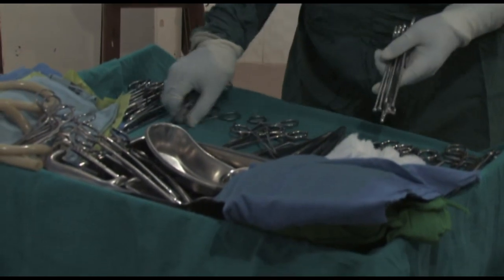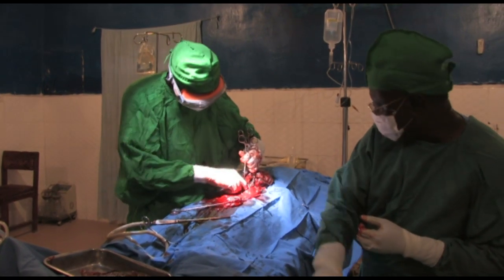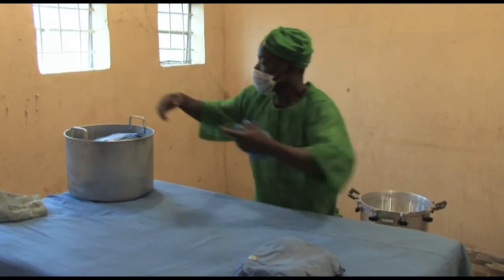The doctors and health professionals in the theatre and other departments may be the ones treating the patients, but the health of the patient is also your responsibility.